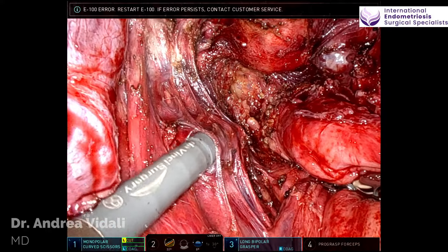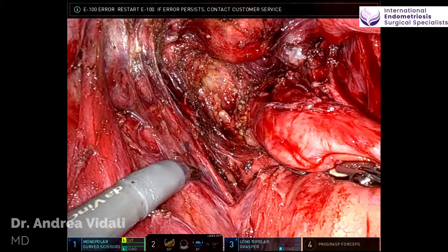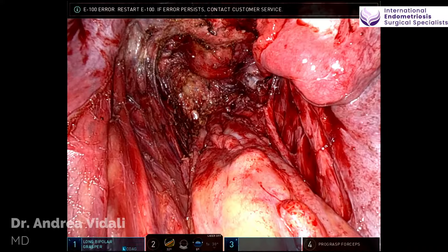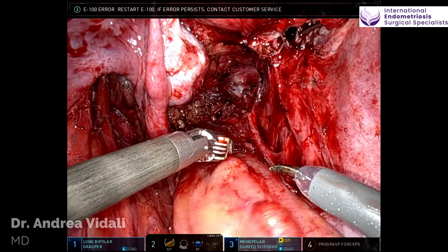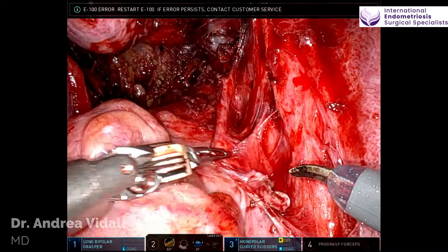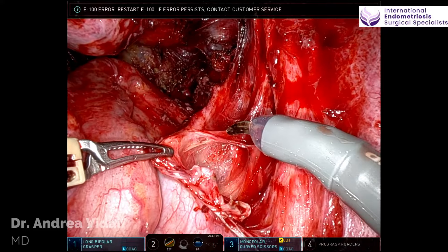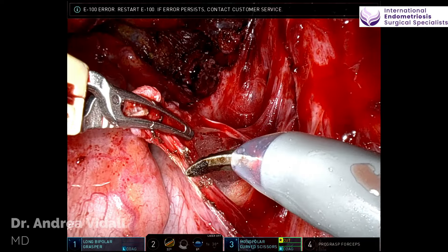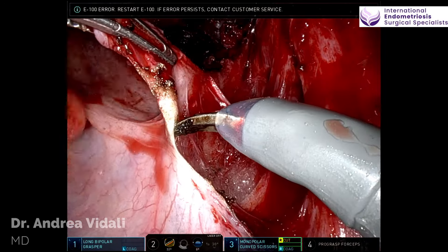It's important to notice and preserve that fascial layer to a maximum degree. As I dissected all the disease out, I strive to maintain the integrity of the fascial layer. Moving to the right side, there is significant disease and tissue alteration, inflammation with desmoplastic changes of the fat along the right utero-sacral ligament.